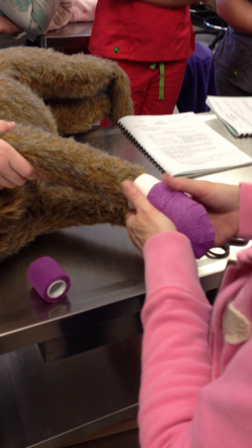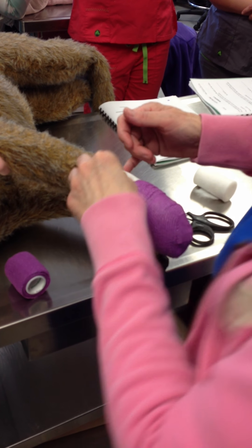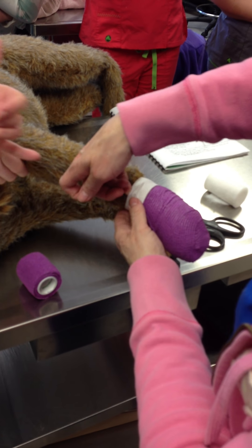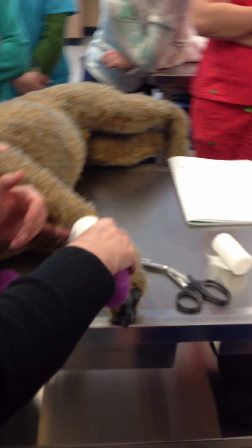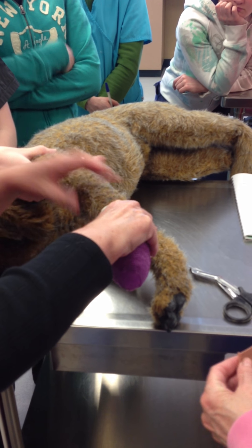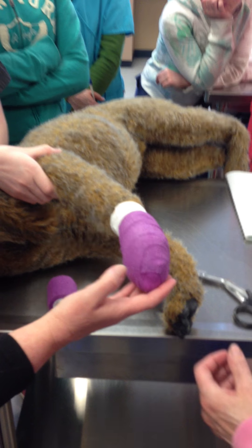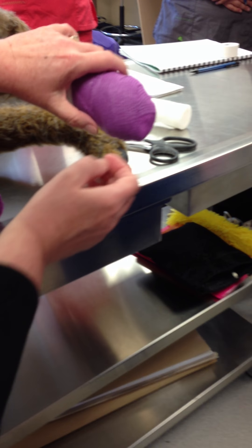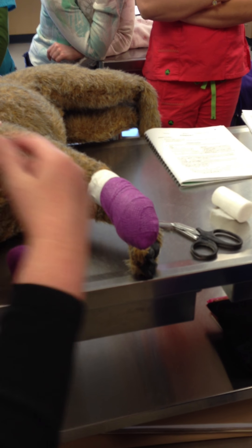All the way around — you should be able to get a little finger under the edge of that to ensure it's not too tight. That's pretty sticky. Well, if it's a real animal, then there's some give to the tissue. But yeah, I can get my finger underneath there. The other thing is that we've got a loose corner here — see what this is going to do? It's going to curl. So you could use a half inch piece of tape and go all the way around and back on itself.